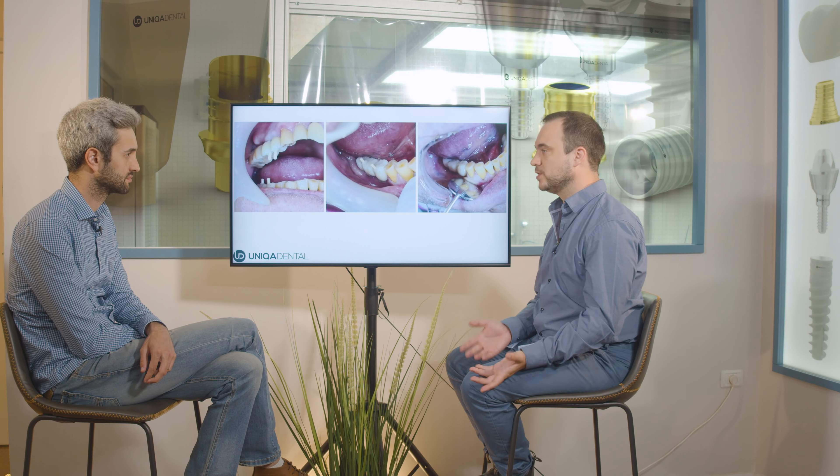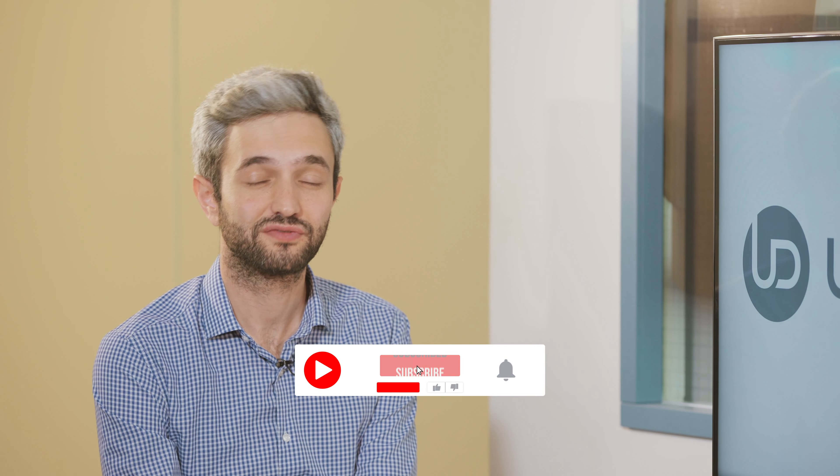What we did today: we extracted the tooth, and instead of placing another implant, we used the existing bridges — two implants on one side and one implant on the other. We removed the bridges and made one new bridge covering the gap, so instead of a bridge of two crowns plus a single crown, we now have a bridge of four crowns on the upper jaw. We also changed the lower jaw.